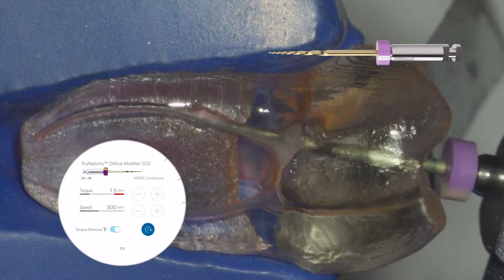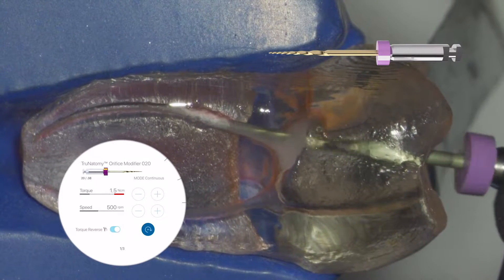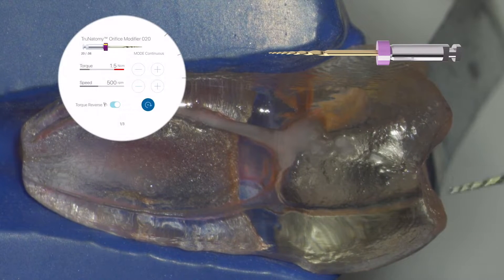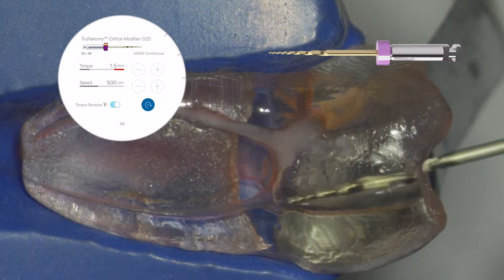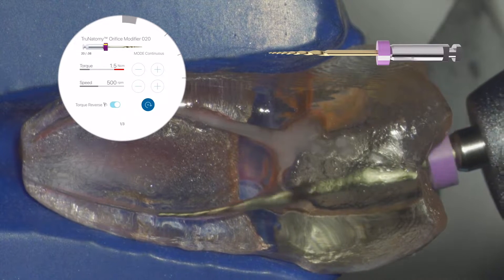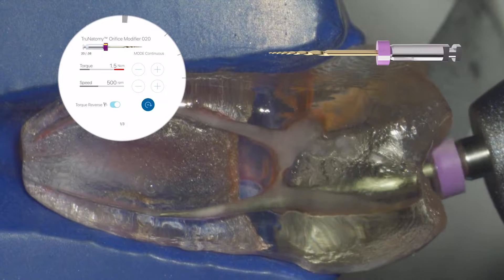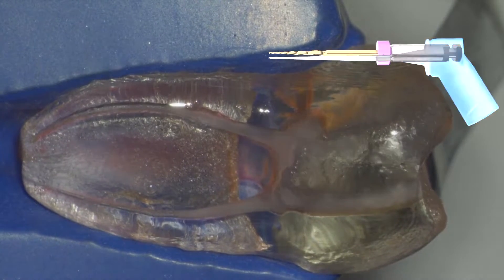Next, you're going to grab the orifice modifier — purple handle with a stopper — and run it at 500 RPMs. Think of waves of motion: one, two, three, out. Make sure that you always clean the debris from the flutes with a two-by-two with alcohol.